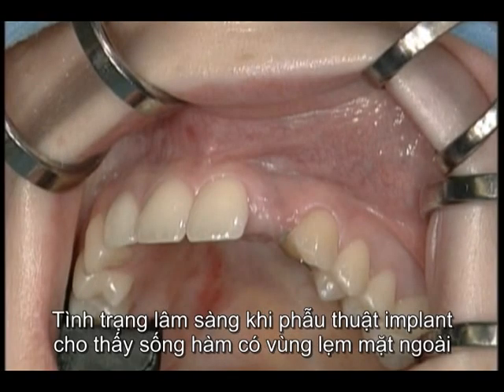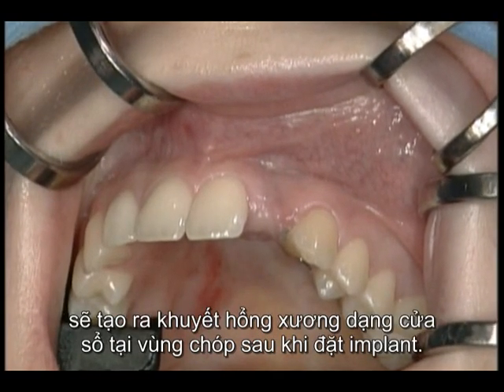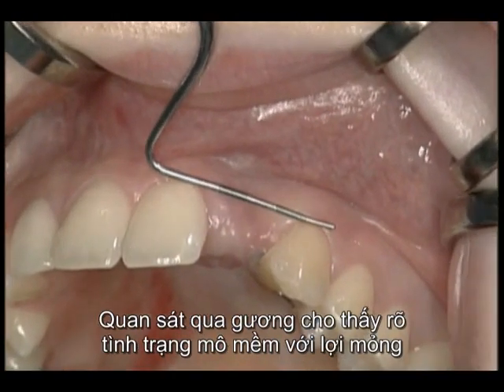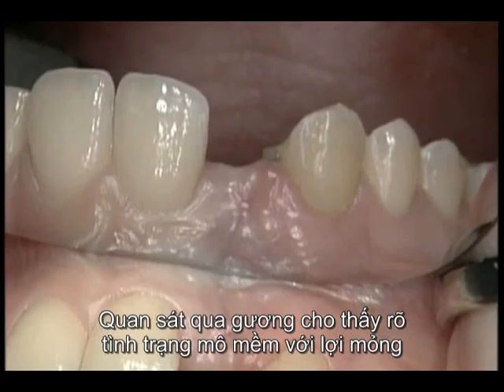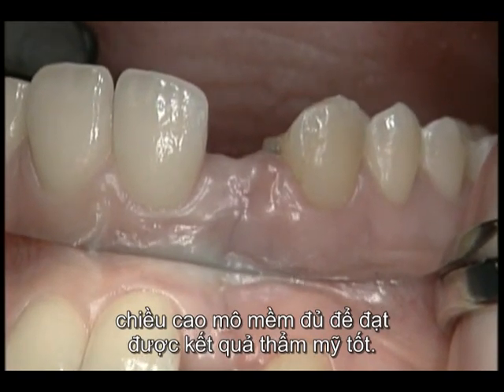The clinical status at implant surgery shows the alveolar crest with a facial undercut that will lead to an apical fenestration defect after implant placement. The mirror view highlights the soft tissue status with a thin gingiva. It shows sufficient soft tissue height for an aesthetically pleasing result.